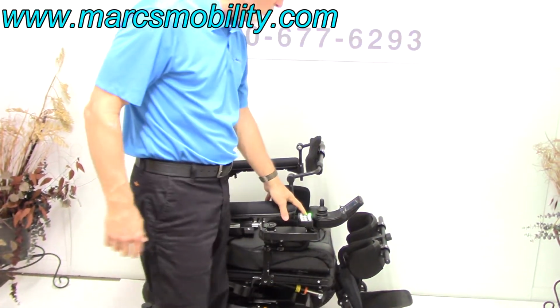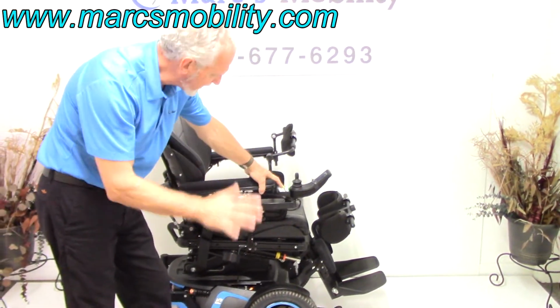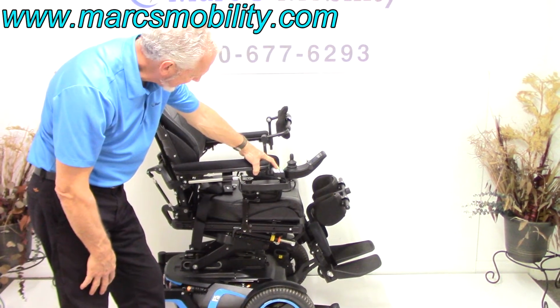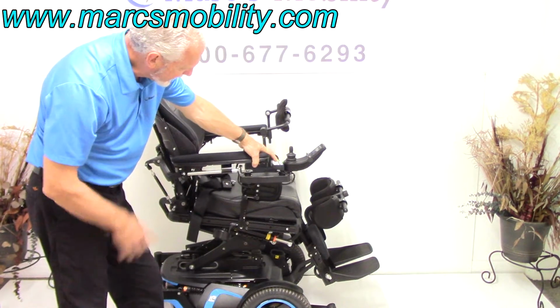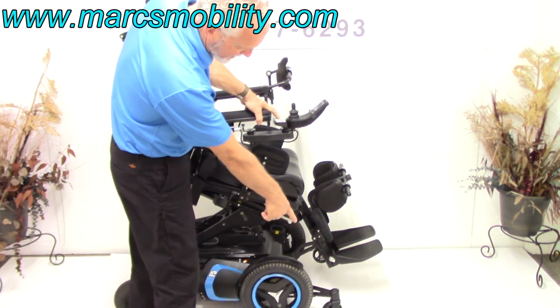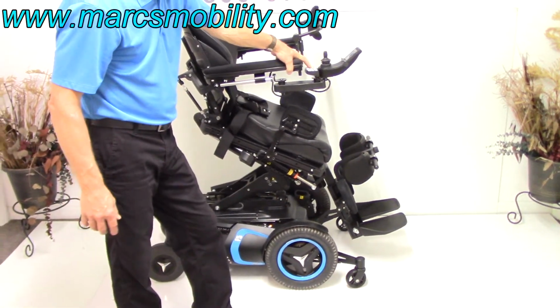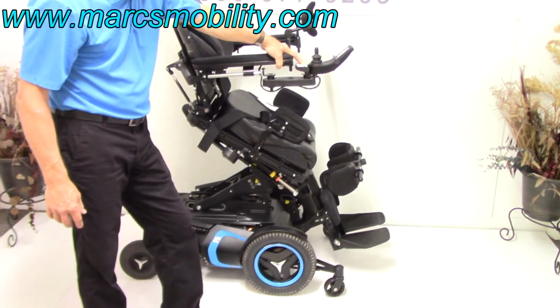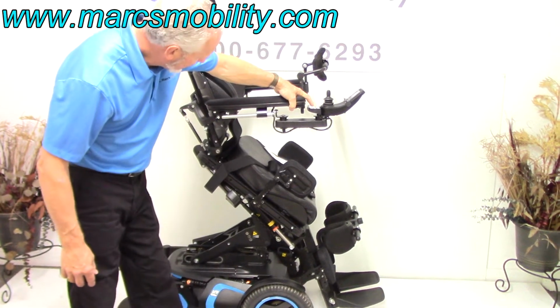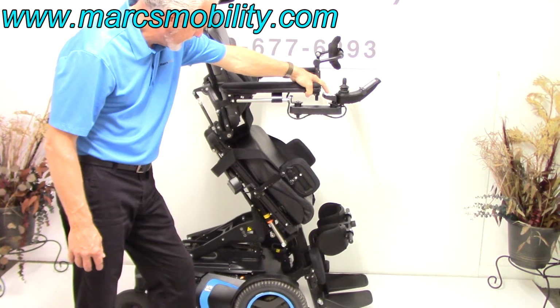Then you would make your seat go up. So now the seat will go up, it'll do all kinds of funky things, but it'll get you standing up here. So this is the standing feature. And you notice when this chair stands up, these front caster wheels, they're going down to the ground now. You watch them? They're going all the way down to the ground to give you more suspension when you're standing up. So this would be your standing feature going up. And this chair right now is adjusted probably for a person 6'1", 225 pounds.